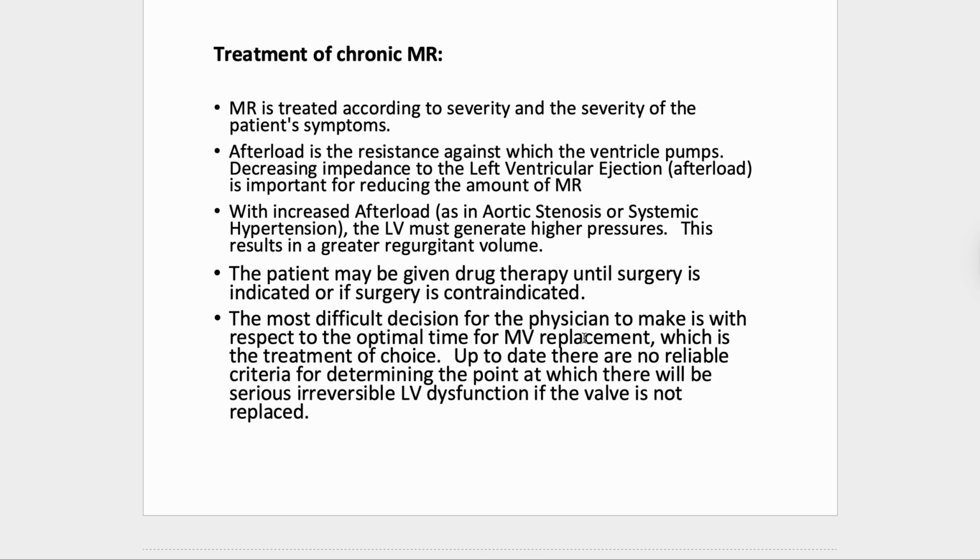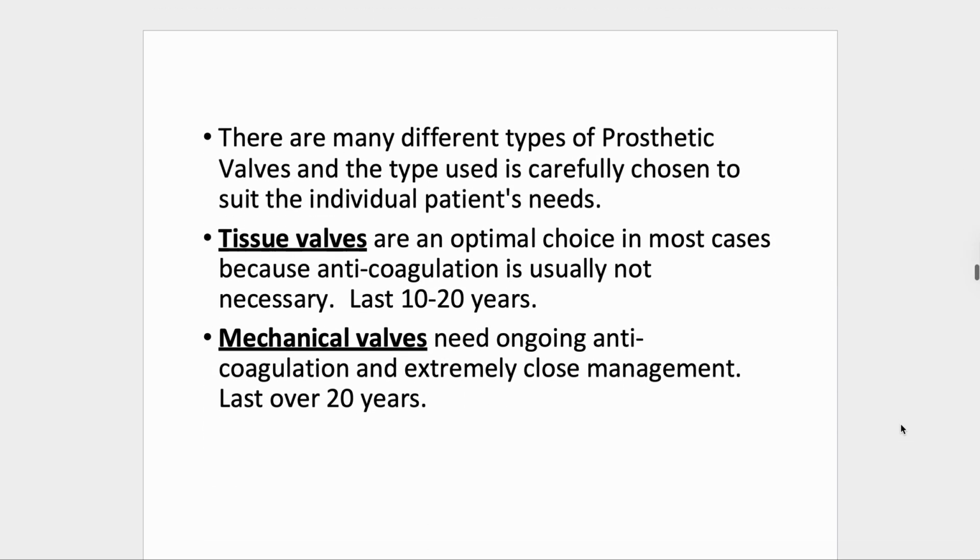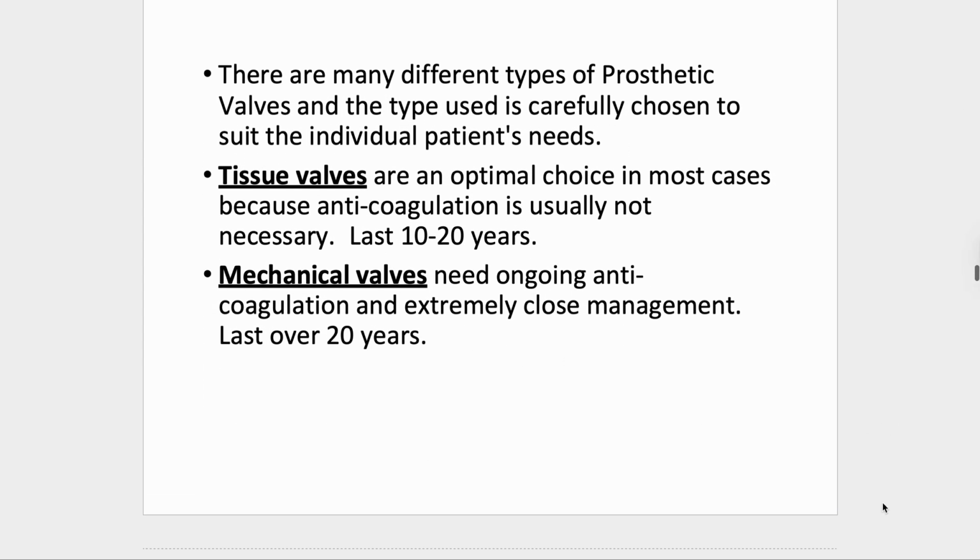If that then doesn't work, now we're headed towards mitral valve replacement. And these are the valves that might be used, prosthetic valves.